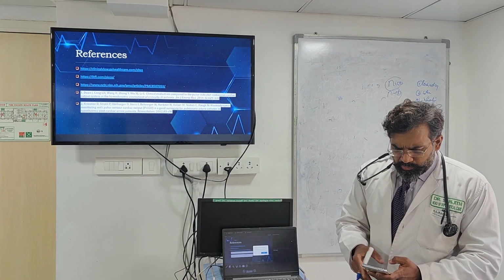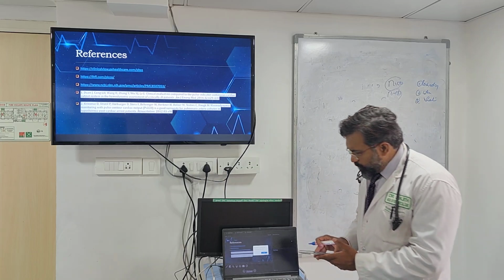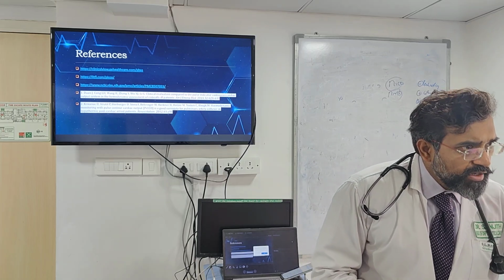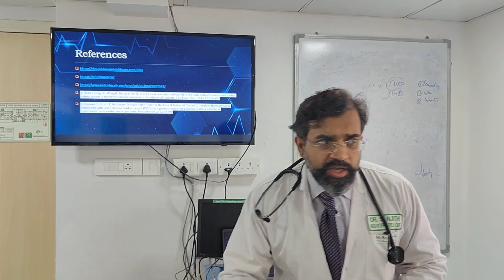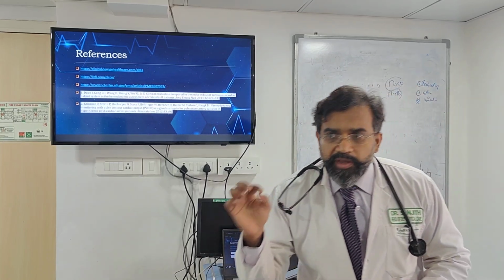Picco, let me just see what all she had written. Okay. So, we used to use the PAC. Now, we cannot forget that the pulmonary artery catheter is a fantastic device. In which cases will you 100% use a pulmonary artery catheter? When there is pulmonary artery hypertension, and when there is RV failure.